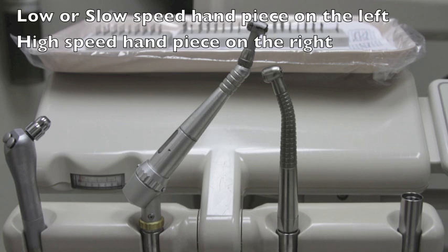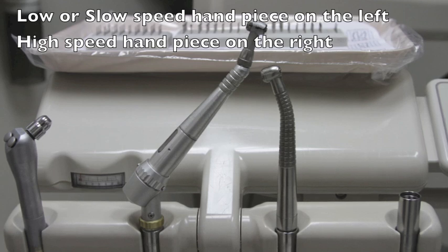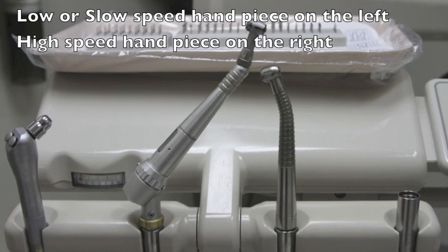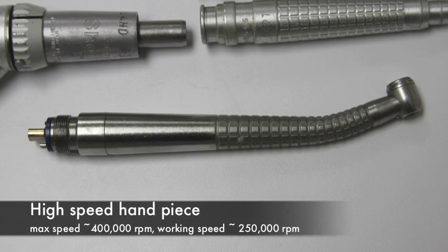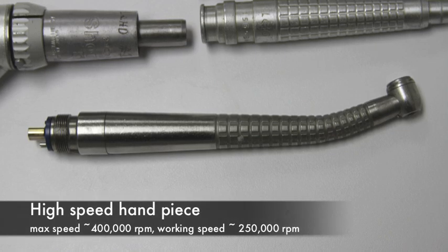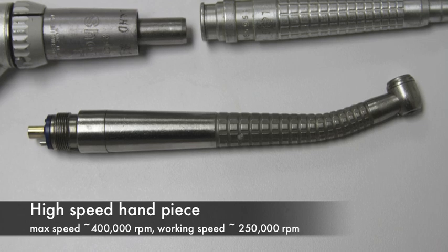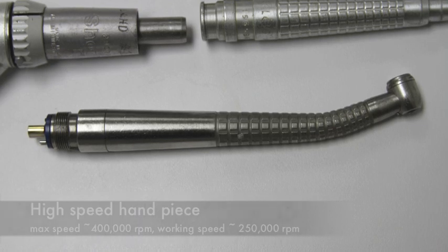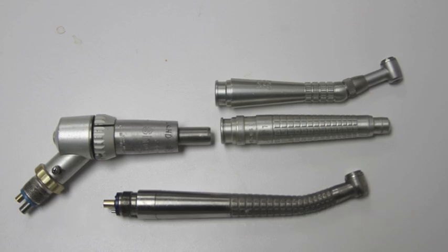The major difference is that high speeds by their nature will tend to cut enamel, whereas slow speed handpieces will tend to cut dentin. They are also used to polish surfaces, cut plastic, and cut a variety of different materials. The high speed is a single unit and does not come apart. If you notice an instrument that does come apart, this is going to be a slow speed, and you'll notice that they have different heads.